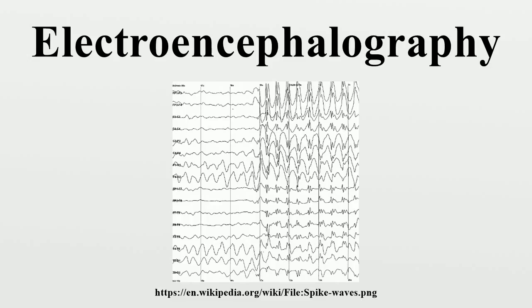Routine EEG is typically used in the following clinical circumstances: to distinguish epileptic seizures from other types of spells, such as psychogenic non-epileptic seizures, syncope, subcortical movement disorders and migraine variants; to differentiate organic encephalopathy or delirium from primary psychiatric syndromes such as catatonia; to serve as an adjunct test of brain death; to prognosticate, in certain instances, in patients with coma; to determine whether to wean anti-epileptic medications.